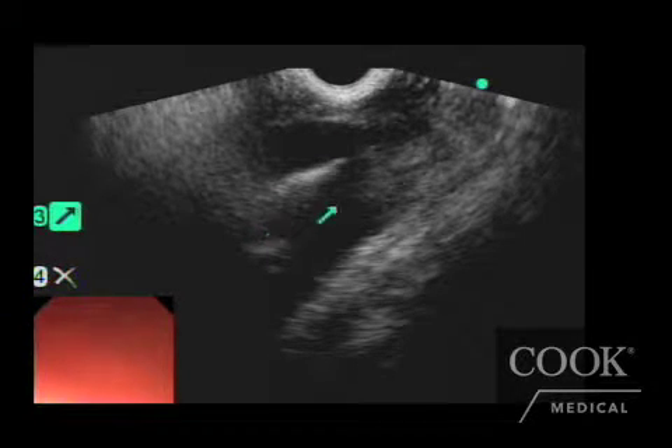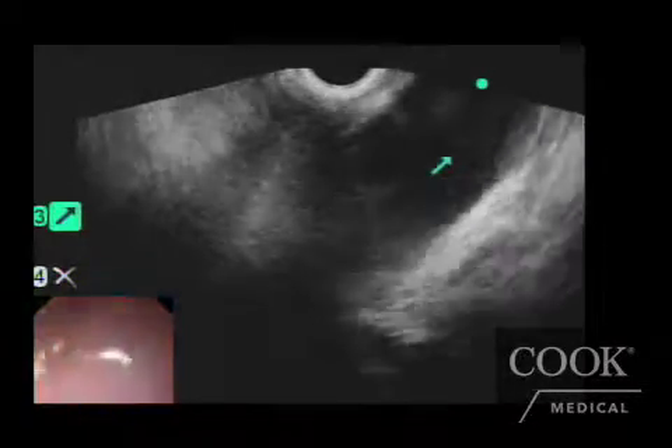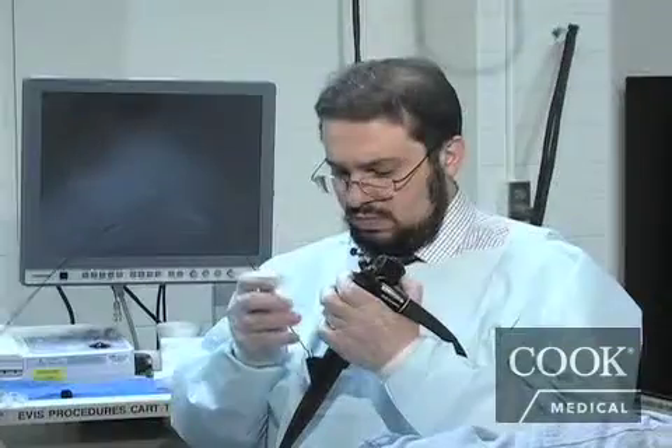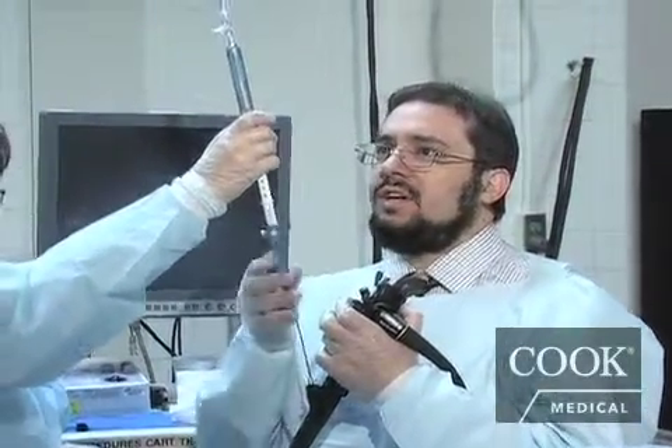In a moment, we'll show you the descending aorta at this level. Also, for confirmatory purposes, we perform color Doppler sonography to identify the celiac artery further and to ensure there are no intervening vessels in the way. The arrow is a good location and estimation of where the needle needs to be. I'm currently using the CPN fenestrated needle — it's a 20-gauge needle, and the advantages are clear with using it.